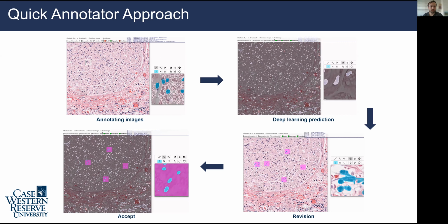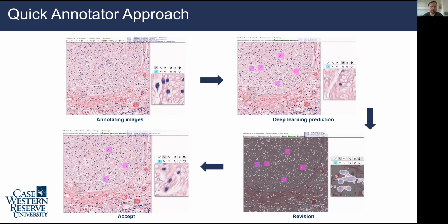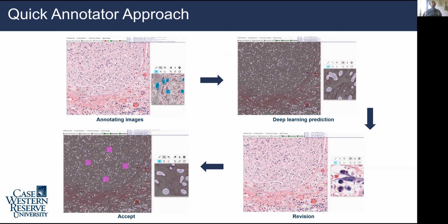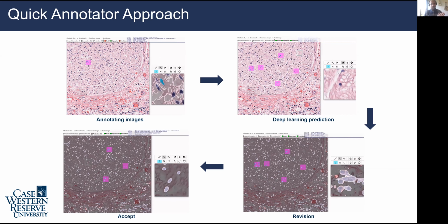Good. We also have a second question. What about the performance of Quick Annotator for not that black and white lesions? So, for example, indistinct borders between healthy and diseased tissue regions. Yeah, so I think the question here is: is Quick Annotator supposed to go and do all of this for you, or is Quick Annotator supposed to make you more efficient at doing this?